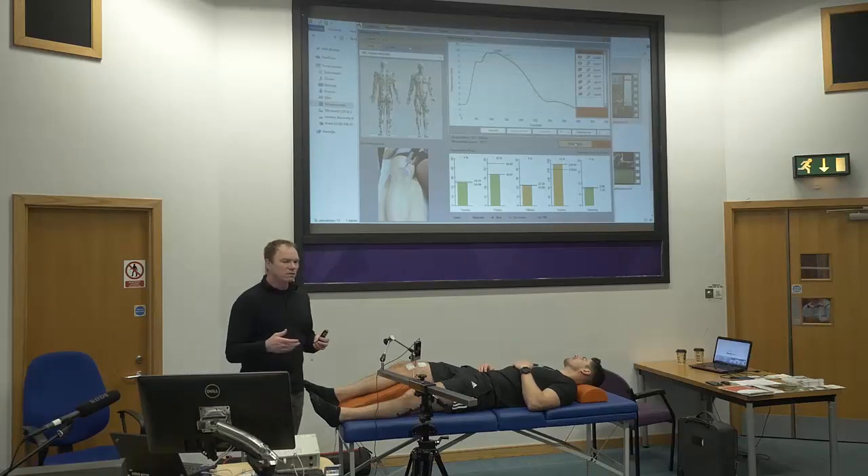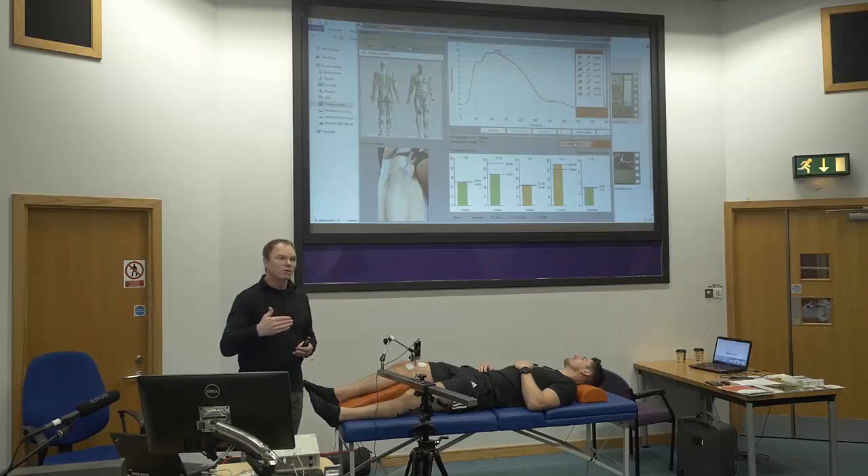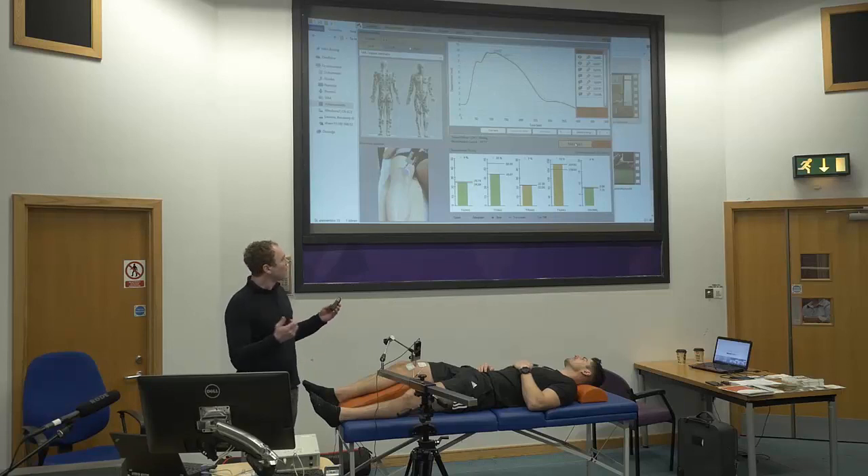Sometimes you have to be a little bit more careful. Here it's not a big problem because you don't have deep muscles interfering too much. But if I were measuring the gastrocnemius muscle, which is thin, and the first peak — the gastrocnemius — is the same, but if I continue to increase current, the second peak will continue to increase. That's the soleus co-contraction increasing more and more. I don't need that, so I can stop when the first peak stops increasing.